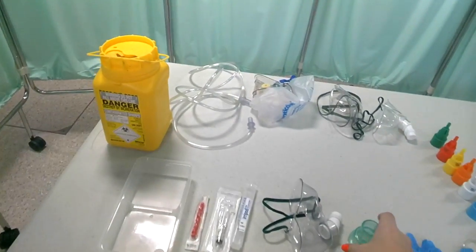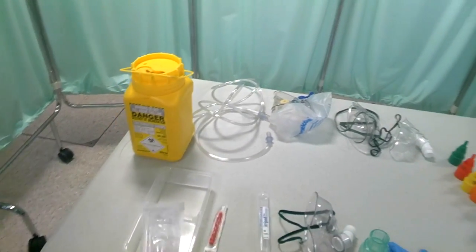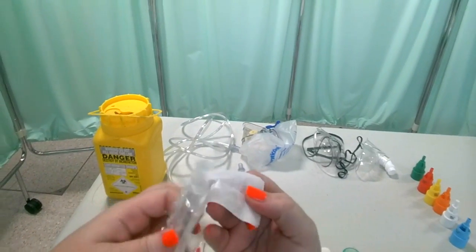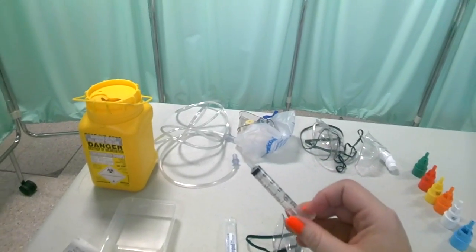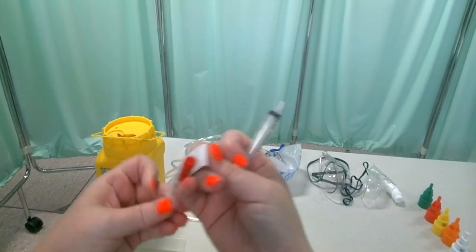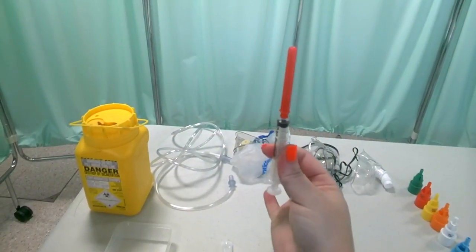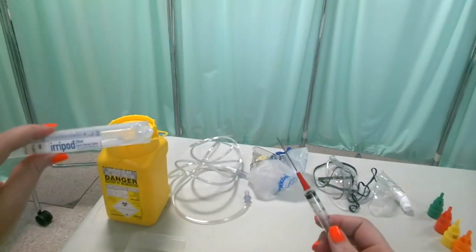So, for example, if we want to give a patient some nebulized salbutamol, we actually have to draw up a very accurate dose. It's not good enough just to squeeze the ampule of salbutamol into the nebulizer chamber. Okay, we actually want to take the care to have an accurate dose, and therefore we draw up all of our medications that we wish to nebulize using a syringe and needle. Now for today's purpose I'm going to just use some saline.